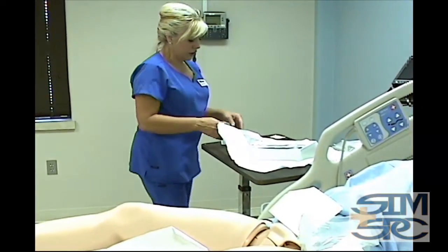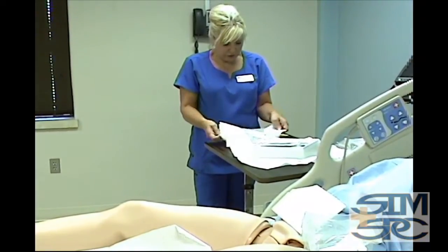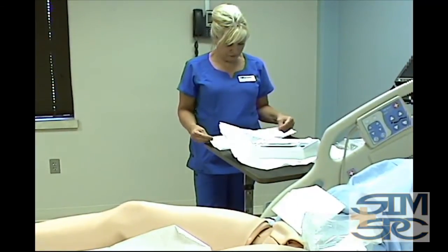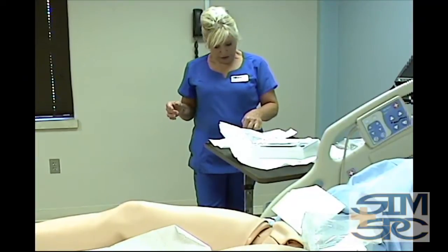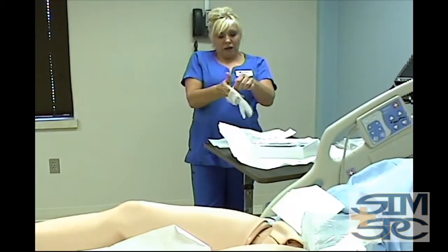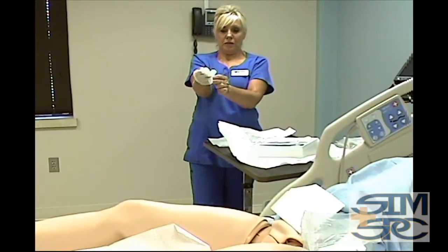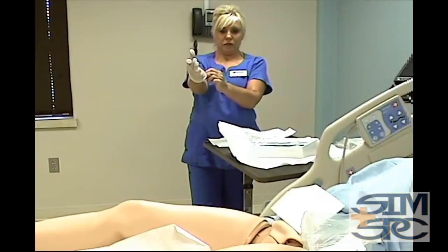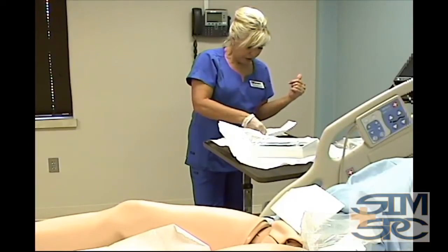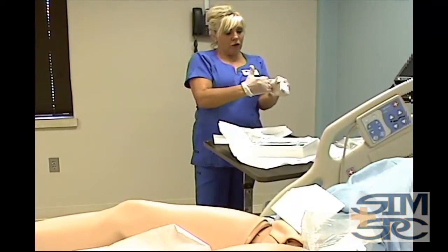Okay, now we're going to come over and put the sterile gloves on so that we can get into the sterile field. I'm going to pick it up by the cuff, hold it up, and look for the thumb. Little fingers, not all the way in there, but I can do it when I get there. Now we're going to go under the cuff of the next hand. We're going to abduct the thumb, or do the hitchhike on the thumb.